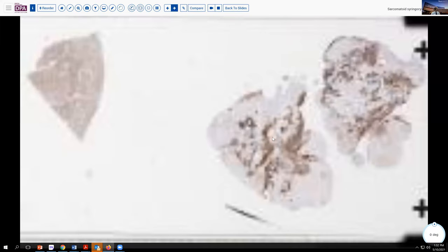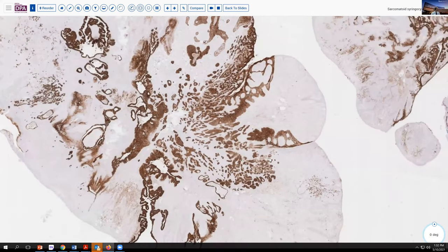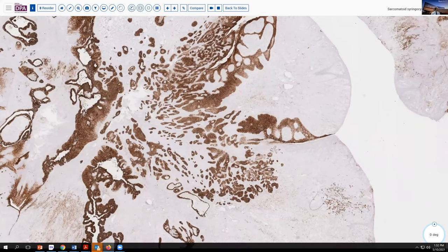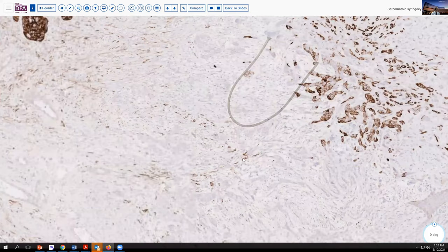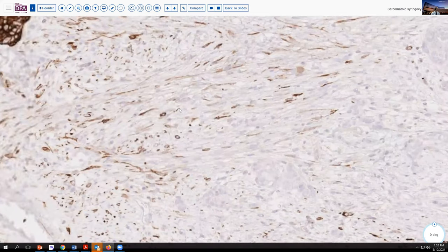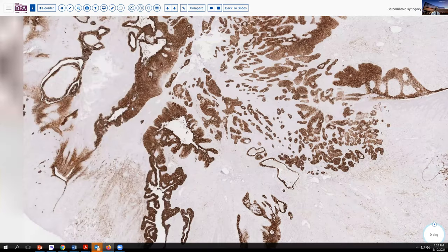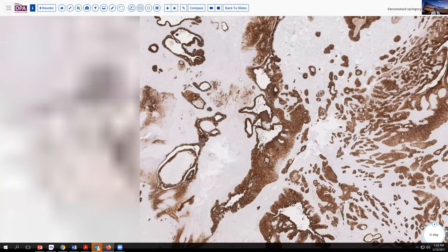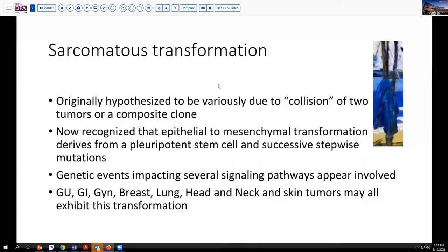And then finally, here we have a pancytokeratin stain — I believe this is CK56. Notice that here we do stain some of these atypical stromal cells. That is the pattern often associated with sarcomatous transformation — this pattern of keratin staining. We see it in the solid areas, and we see it here also in these glandular and tubular areas as well, as well as this fine glandular area. So there are some helpful things.